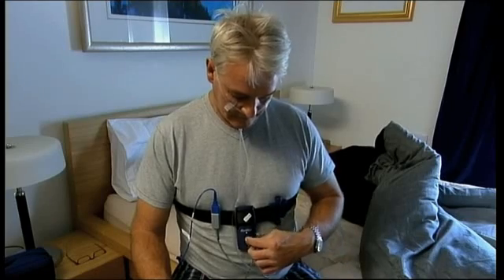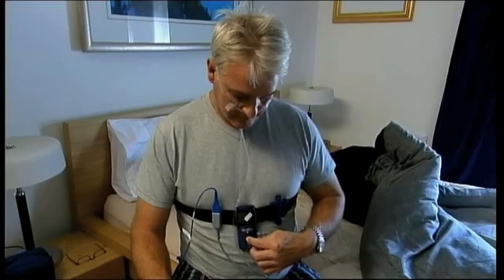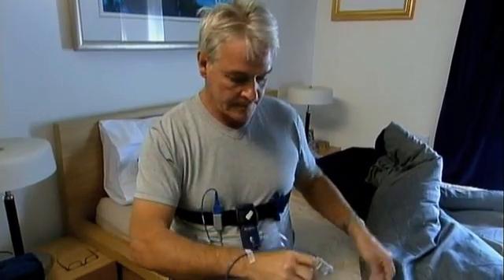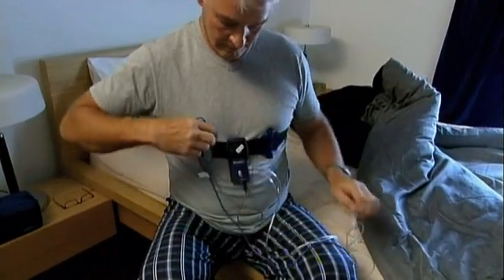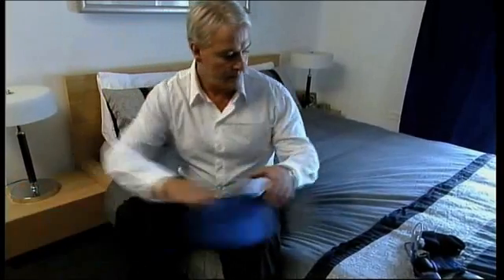When you wake in the morning, turn the recorder off by pressing the button until the green light goes off — this should take one to two seconds. Then remove the tube from your nose and the tape and sensor from your finger. Save all the components and return the ApneaLink Plus system to your clinician for analysis.